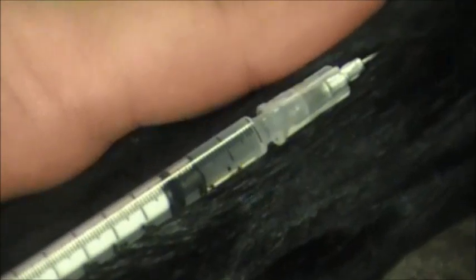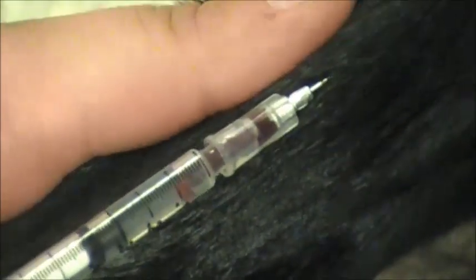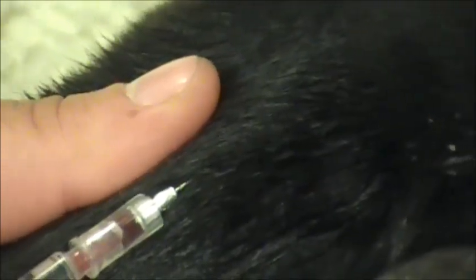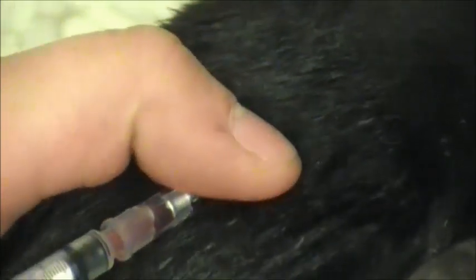So into the vein — I'm going to draw back. I've got blood, so you can let up. And then I'm going to slowly inject into the vein. Then I'm going to put my thumb over it so I don't get any bleeding, and if you want, just hold that off for a couple of minutes.